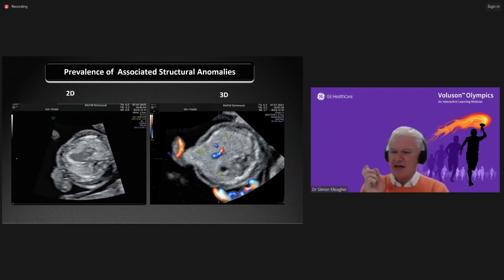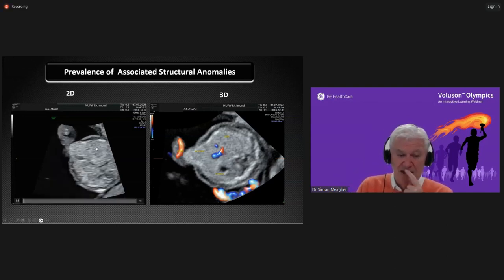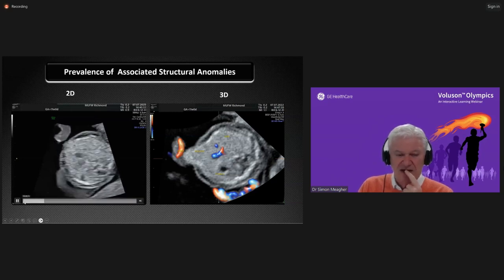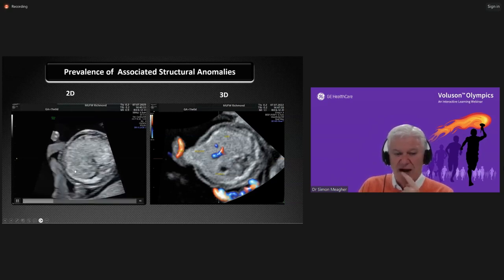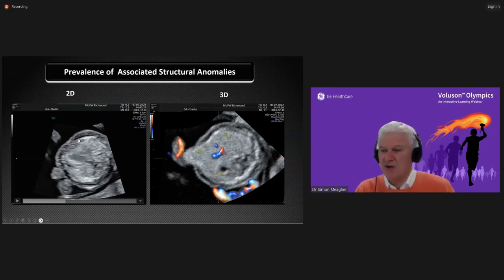So the other thing I'd like to mention to you is that with regard to the first trimester, it's a unique time and very different to the second trimester because quite frequently we'll have associated structural abnormalities. So when you've detected a cardiac abnormality, let's say this baby at 11 weeks, if you look at this image, you can see at the very beginning that you have a heart where the right ventricle is underformed. So this is the descending aorta defining the left atrium, the left ventricle, and there's no right ventricular cavity. So this is a baby with a hypoplastic right heart.